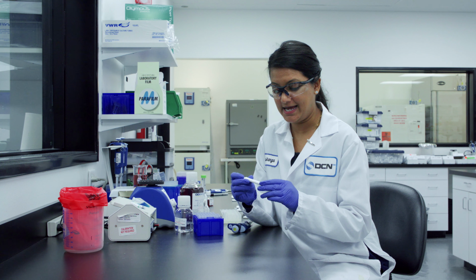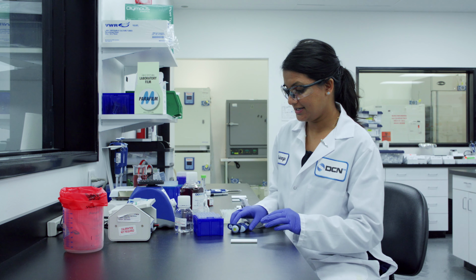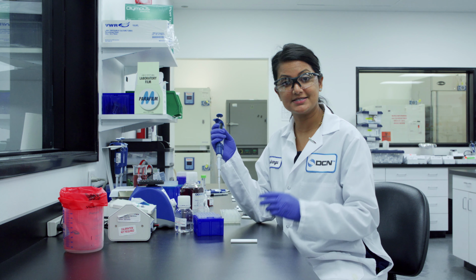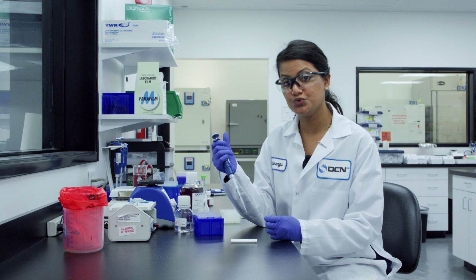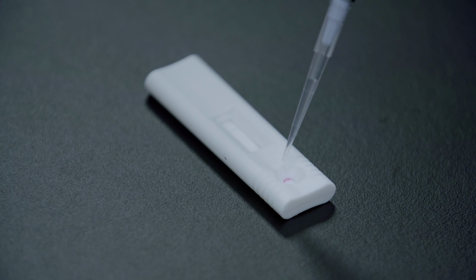All right, so now we have our final lateral flow cassette. And I am going to test to see if we get a positive or negative. So I've prepared a positive solution, and we should see 2 lines once it is done developing in 10 minutes.